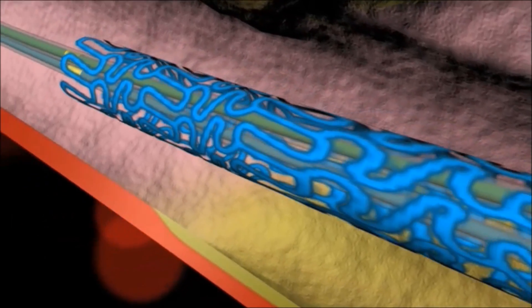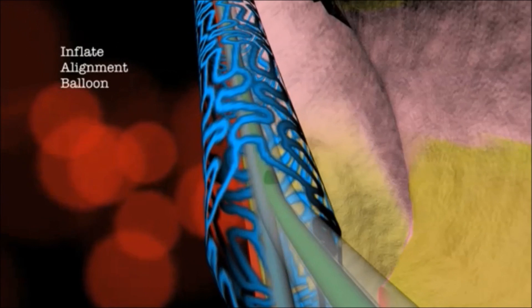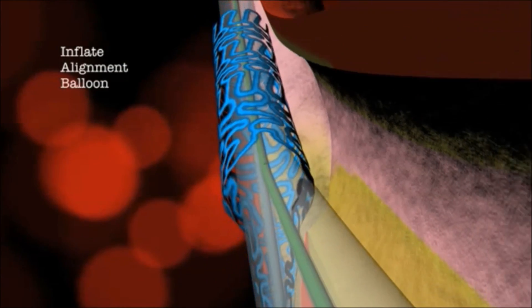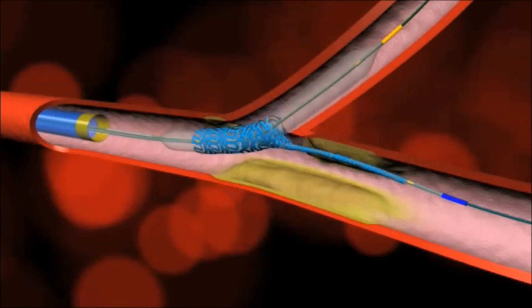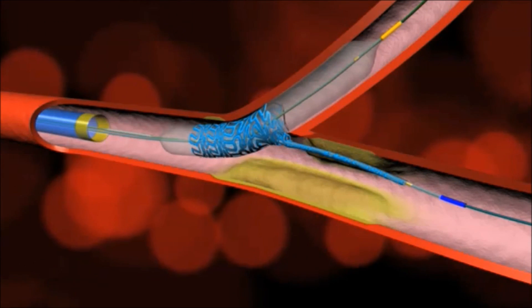Proximal segment of the mother stent is then deployed first with inflation of the daughter balloon. Note perfect alignment of the stent and coverage of the tissue into the ostium of the side branch.